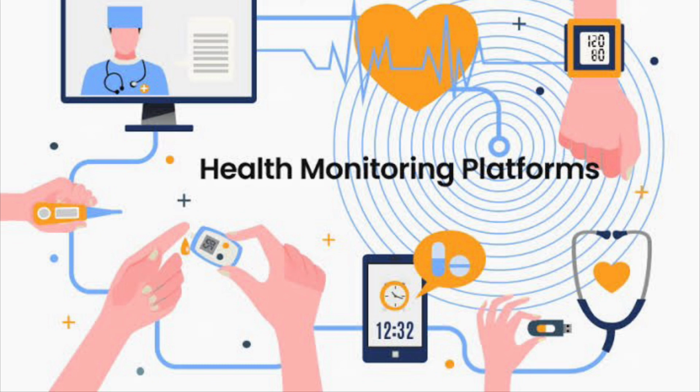Is it the category of patients in the intensive care unit, or a definite subset of patients like post-cardiothoracic surgery patients or coronary bypass surgery patients? What is the subset of patients you want to monitor? Now, the next step is to set your goals. What does success look like for your program? After implementing this and looking back after some time, how do you say that this is a successful program?